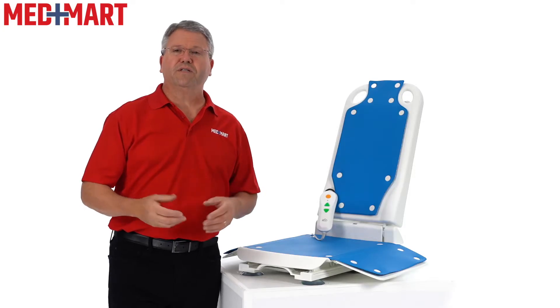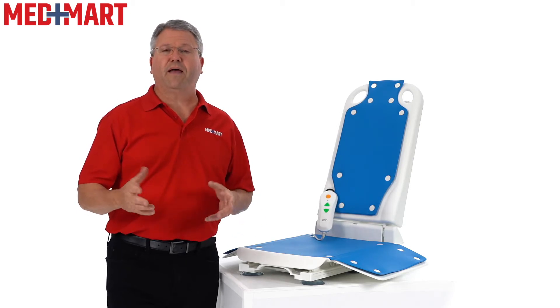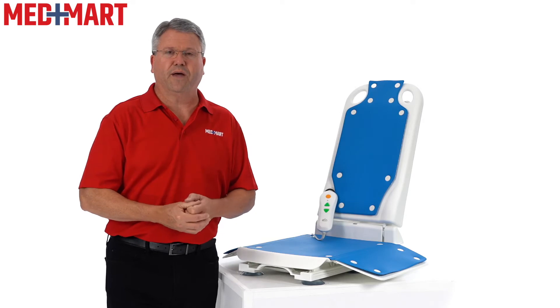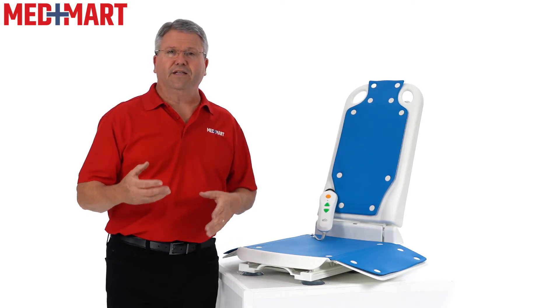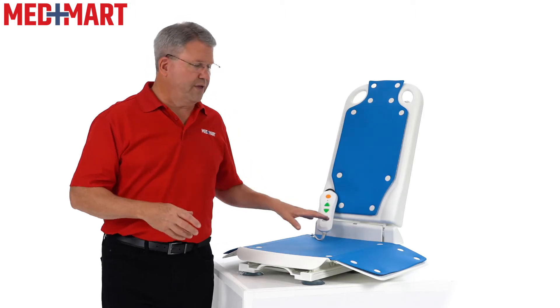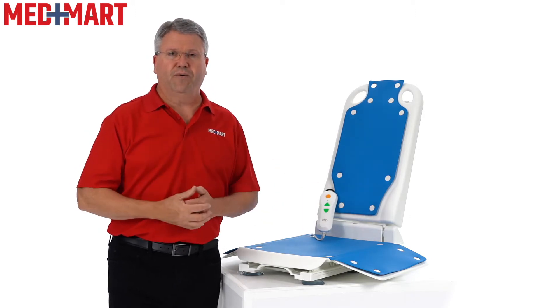This lift features tool-less assembly and takes usually just a few minutes to set up right out of the box. I do recommend having a second person with you to make it easier to lift it out and get the styrofoam cleared out of the way. The longest part in the beginning is to get the unit charged up, so as soon as you get it out, plug the hand control into the charger. It takes about two and a half to three hours and you're good to go.